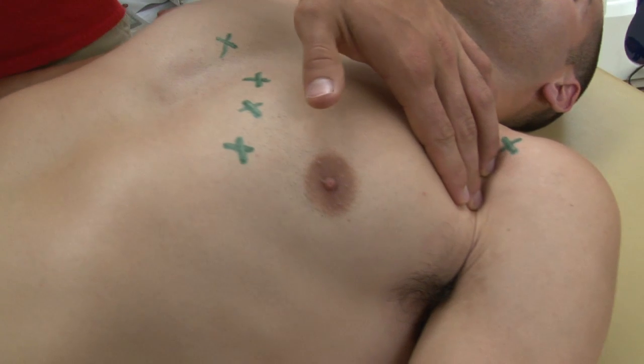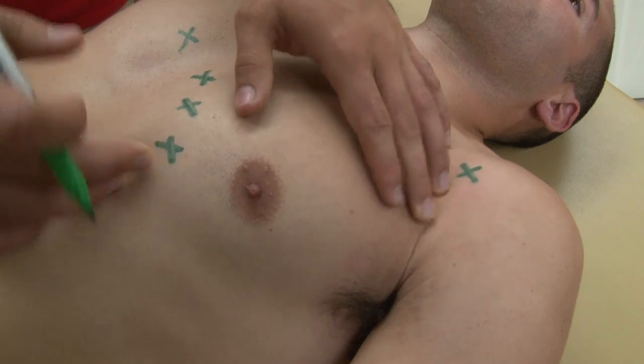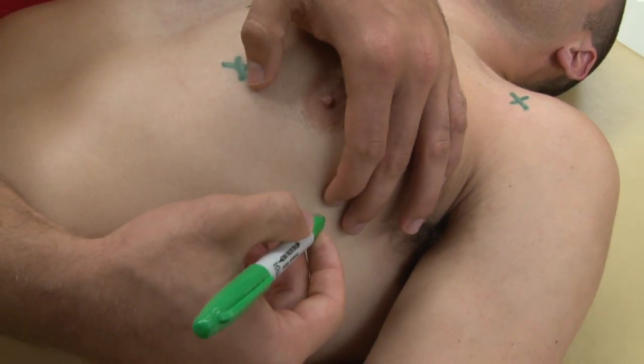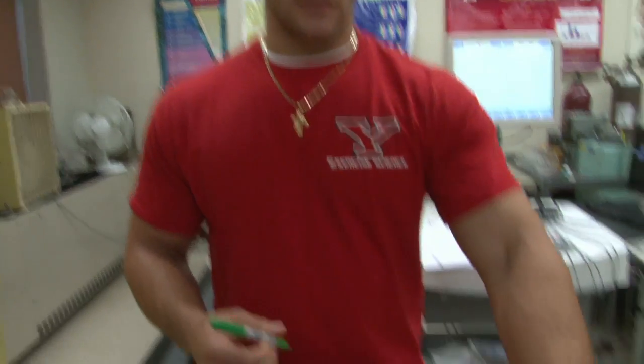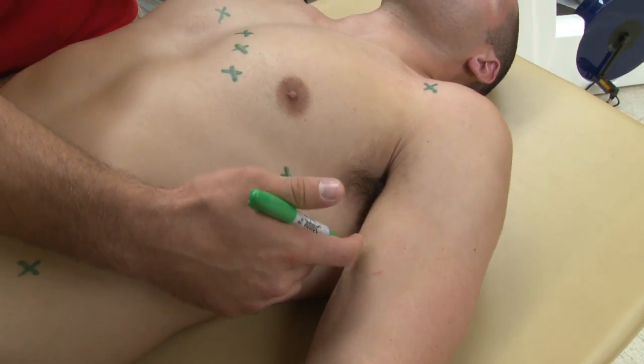Next, we're going to go to the V5 lead, which is going to be in line with the anterior axillary line — right at the anterior aspect of the armpit — at the same level as the V4 lead, on the fifth intercostal space. Finally, we're going to mark where the V6 lead is going to occur, and that's going to be in the mid-axillary line — the center of the armpit — at the same level as V5.